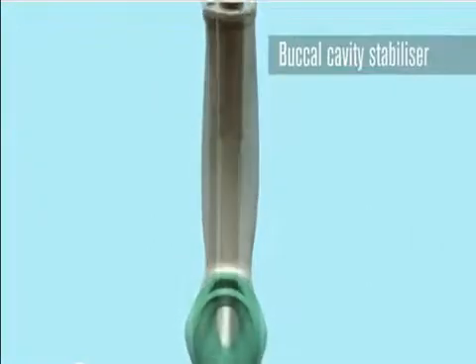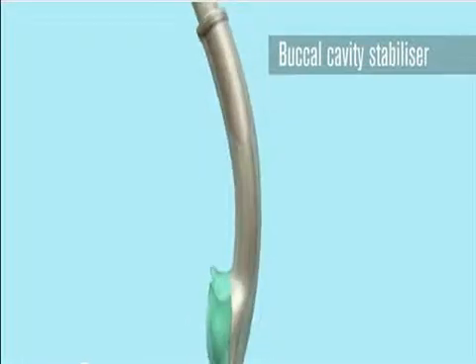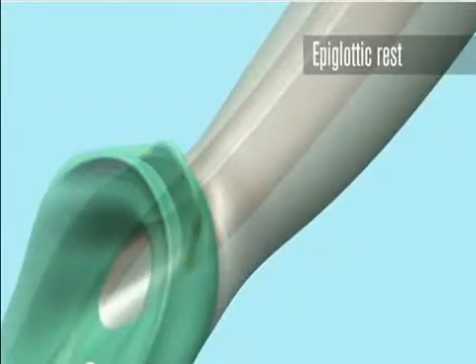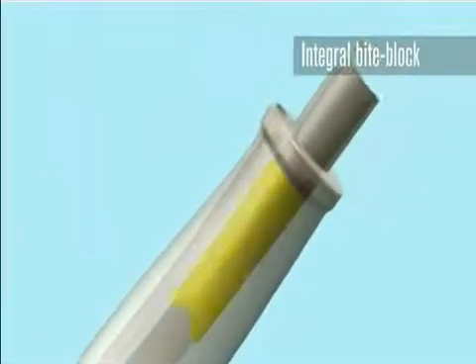The buccal cavity stabilizer eliminates the potential for rotation and aids insertion. An epiglottic rest helps to prevent the epiglottis from downfolding or obstructing the distal opening of the airway. The 15mm connector extends inside the airway tube far enough to provide an integral bite block.